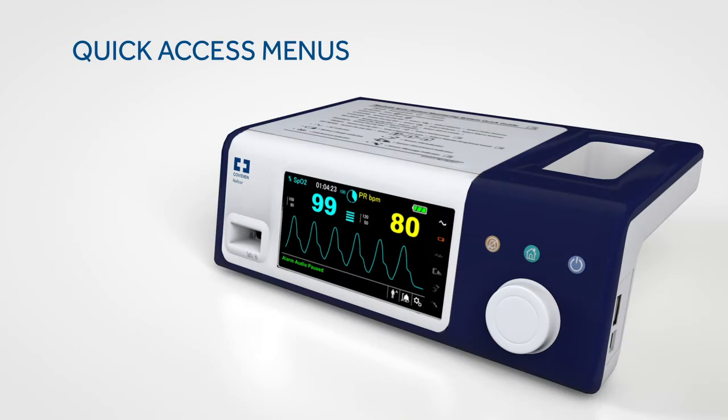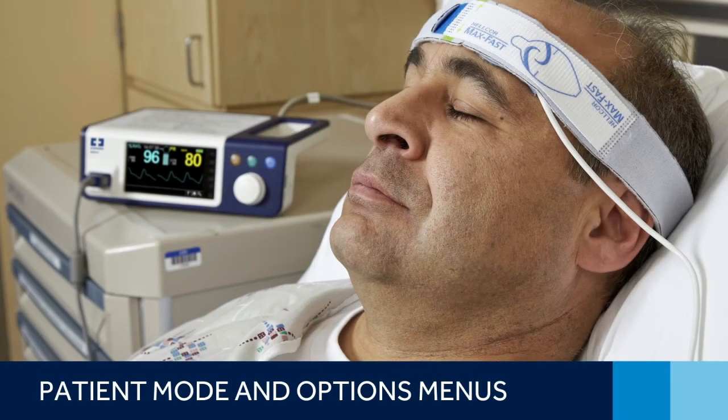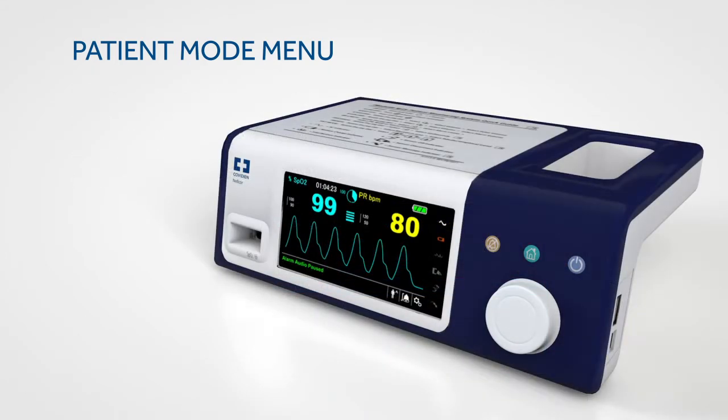For quick access to alarm settings, rotate the jog dial to highlight one of two areas and press. The patient mode menu allows you to choose settings for adult, paediatric, or neonatal patient. To access this menu, just rotate the jog dial to highlight the patient mode display area and press.